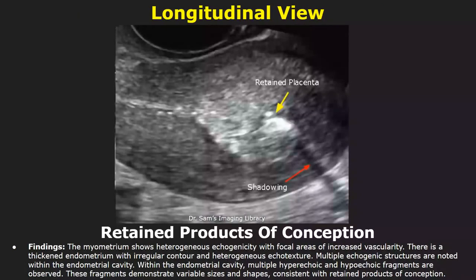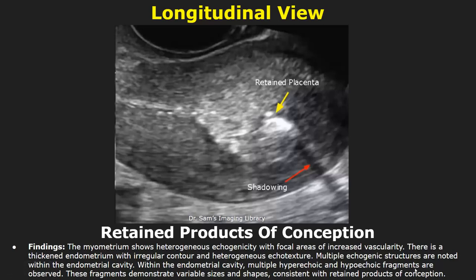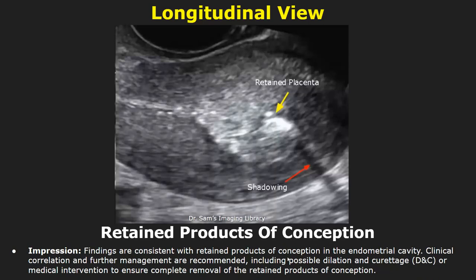Now we will look at retained products of conception. The myometrium shows heterogeneous echogenicity with focal areas of increased vascularity. There is a thickened endometrium with irregular contour and heterogeneous echotexture. Multiple echogenic structures are noted within the endometrial cavity and multiple hyperechoic and hypoechoic fragments are observed. In the impression, the findings are consistent with retained products of conception in the endometrial cavity, and you can advise DNC or medical interventions to ensure complete removal.